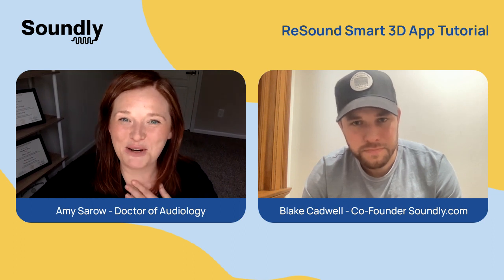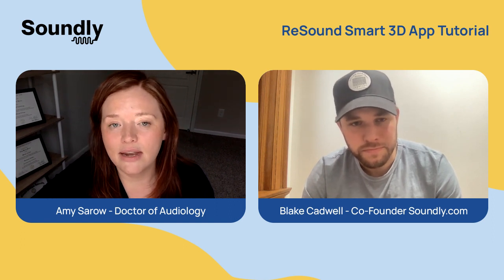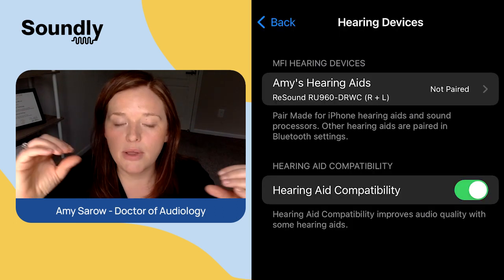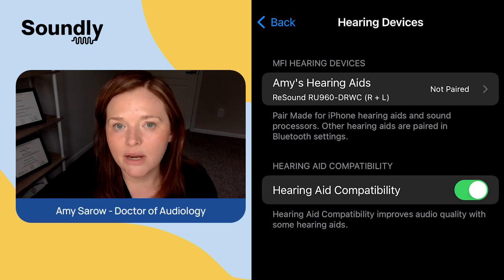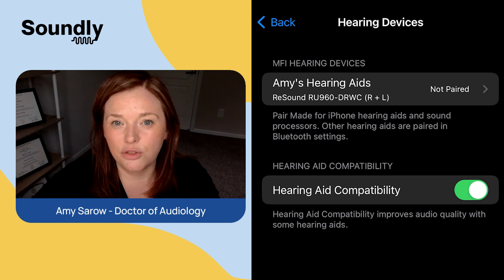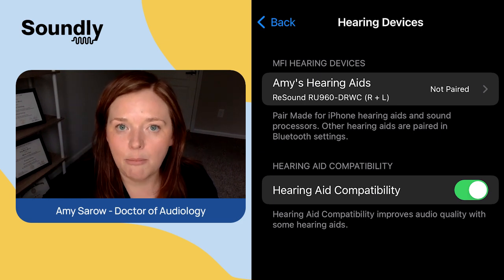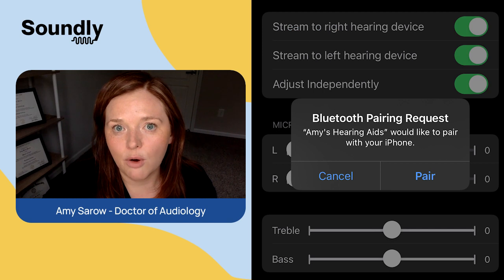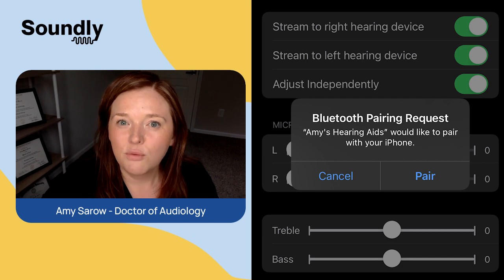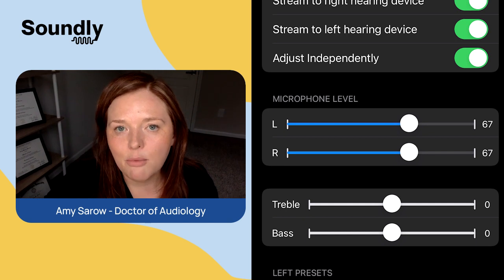So if you have an iPhone, you're going to go to your Settings, then Accessibility and Hearing Devices. You should see the devices popping up in that screen at the top. If you don't see them there for some reason, you can turn off the hearing aids and then turn them back on, or just put them in the charger and pull them out. You'll see them at the top. Then you'll select where it says "not paired." You should then get two pairing requests, and you'll just say yes, pair, two times.